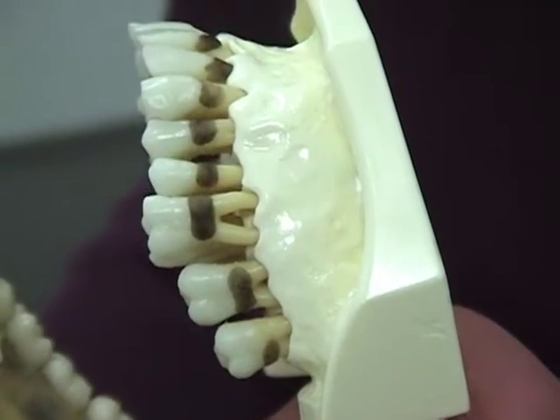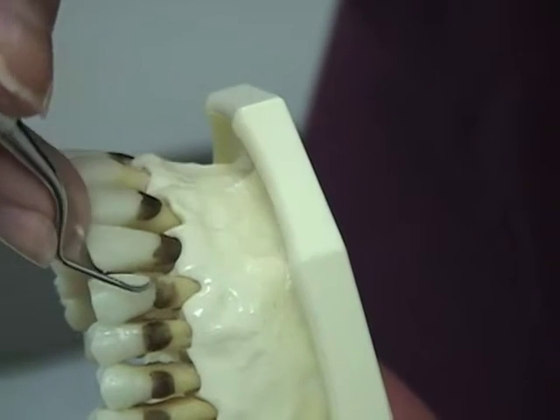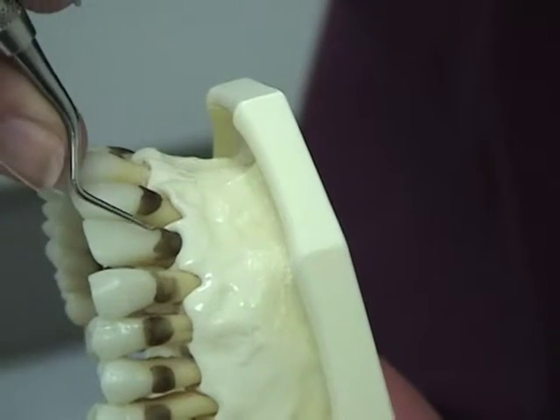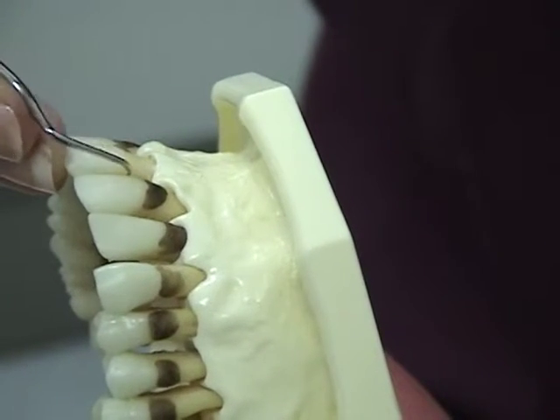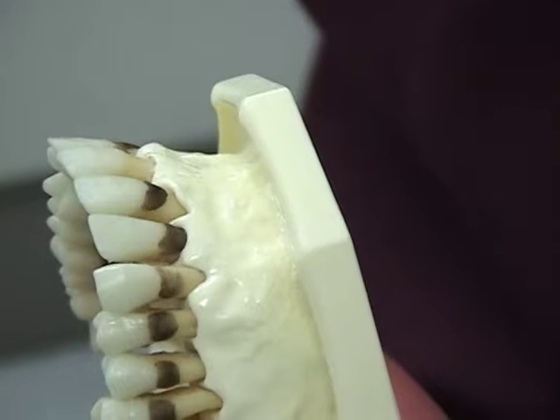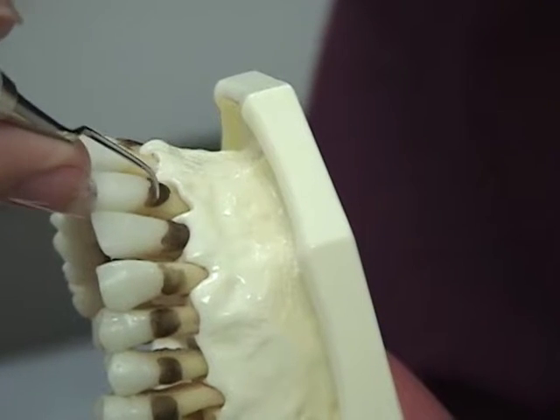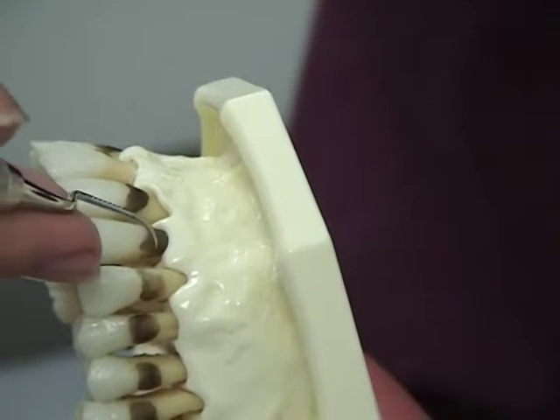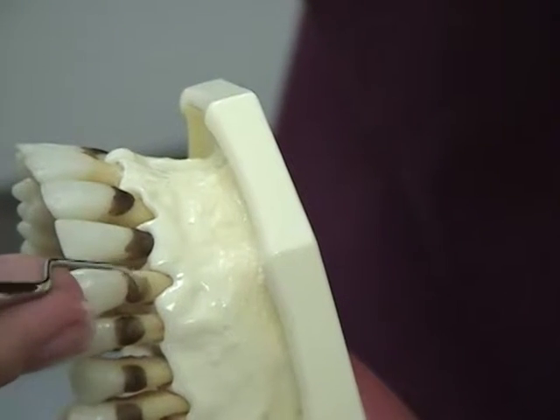For anterior teeth, you will be adapting the instrument from the midline to all surfaces towards you. Notice how she keeps the end of the instrument in contact with the tooth at all times. Then, using the other end of the instrument, adapt from the midline to all surfaces away from you. The technique is the same for both lingual and facial surfaces of anterior teeth.